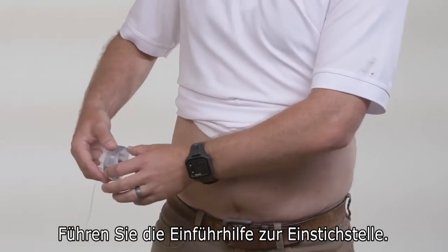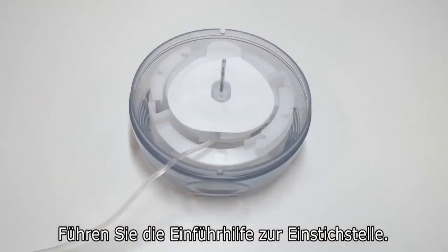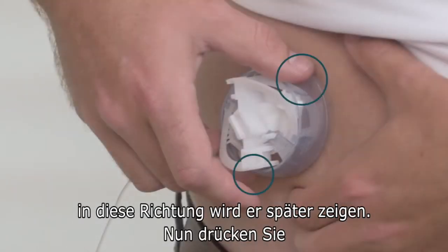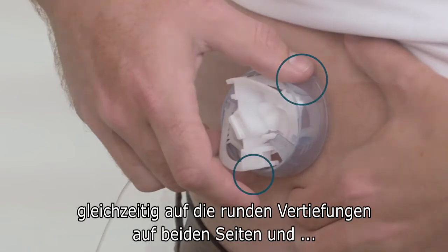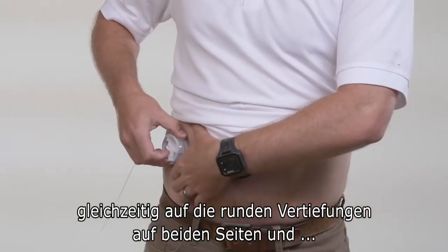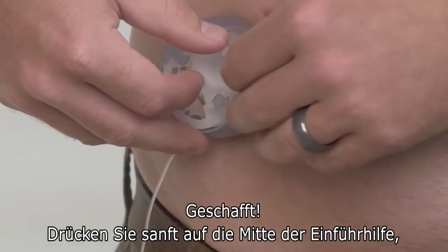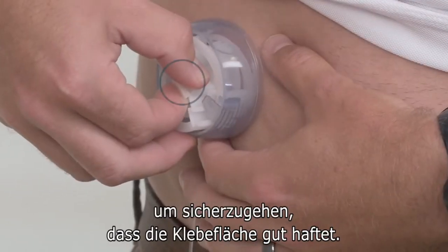Put the inserter over the area you've selected for your site. You can choose which way the tubing will face by looking for where it attaches to the cannula housing. Activate the inserter by pressing the round indents on either side at the same time. Then press the middle of the inserter gently to make sure the adhesive is stuck on well.